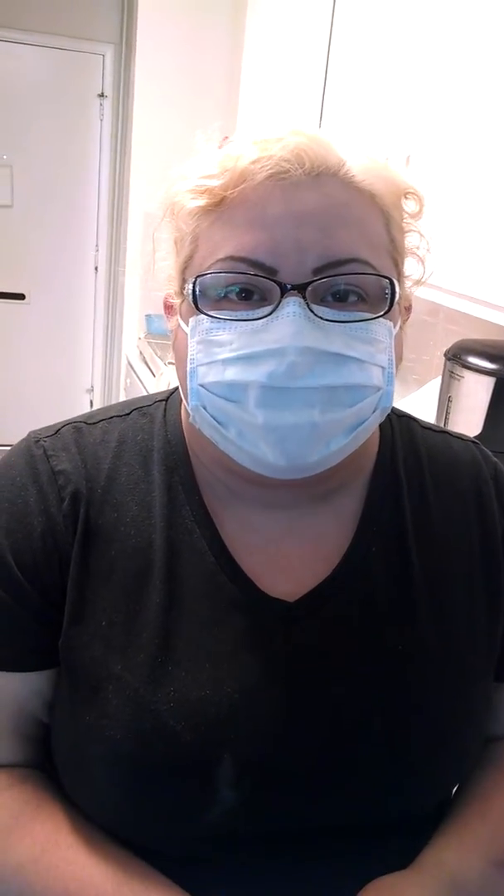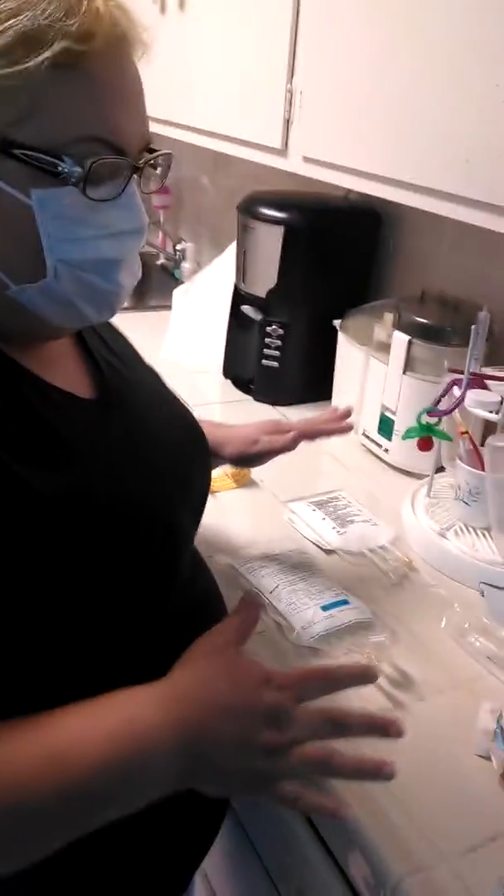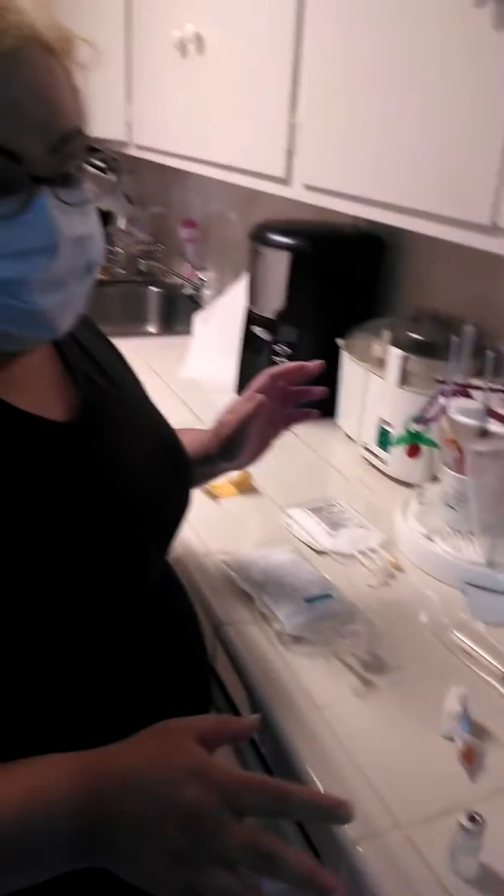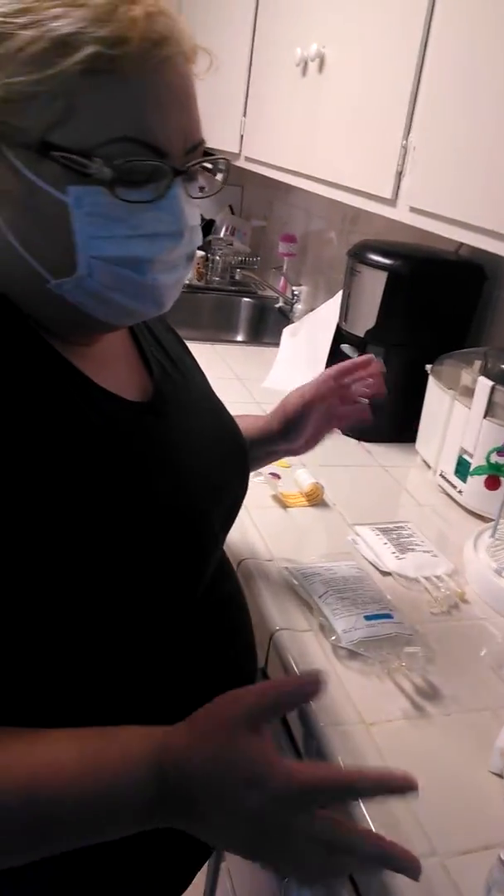So we just finished washing our hands and now I'm going to be adding the multivitamin, reconstituting it, and adding it to the TPN bag. First I wiped my area clean while working with antibacterial spray — 99%, I think it was Lysol. And then I brought all my stuff out.